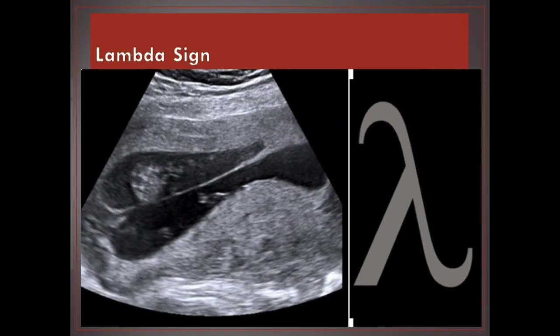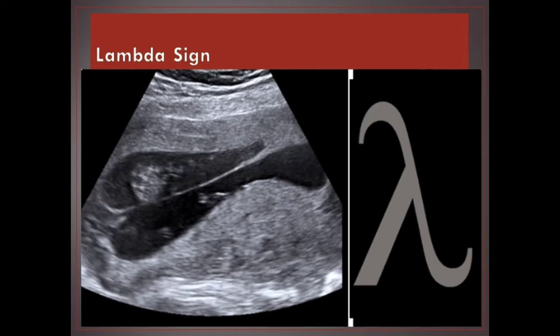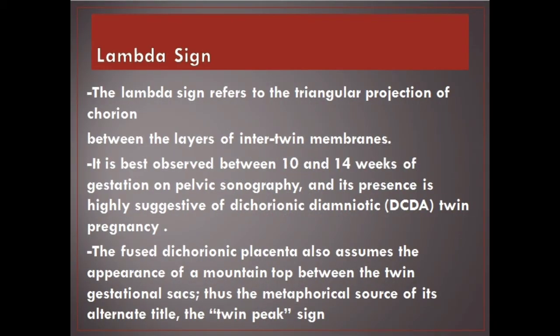Lambda sign. The lambda sign refers to the triangular projection of chorion between the layers of inter-twin membranes. It is best observed between 10 and 14 weeks of gestation on pelvic sonography, and its presence is highly suggestive of dichorionic diamniotic (DCDA) twin pregnancy. The fused dichorionic placenta also assumes the appearance of a mountaintop between the twin gestational sacs, giving rise to its alternate title, the twin peak sign.